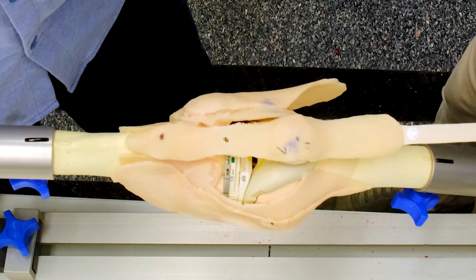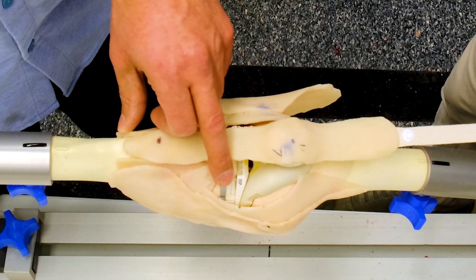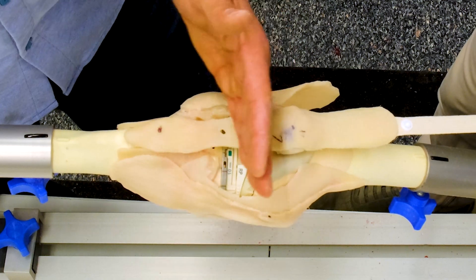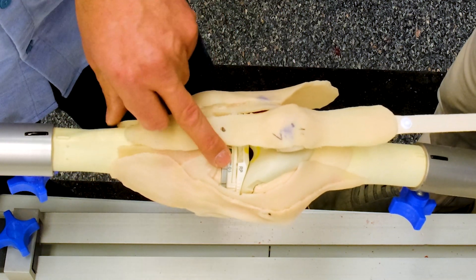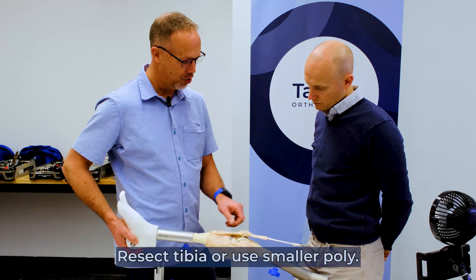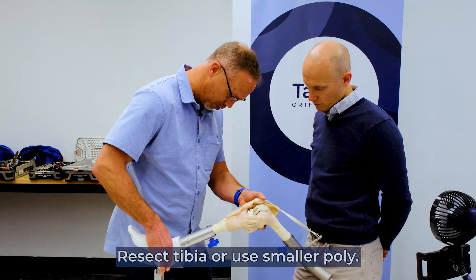Tight in both is an easy fix — it means that our joint is overstuffed. If we're at the lowest polyethylene, then we have to recut our tibia and take more bone to lower that tibial cut. If we've got room to play in our polyethylene, then we can simply put in a smaller polyethylene and see if that corrects our problem. So let's try that and see how that goes.